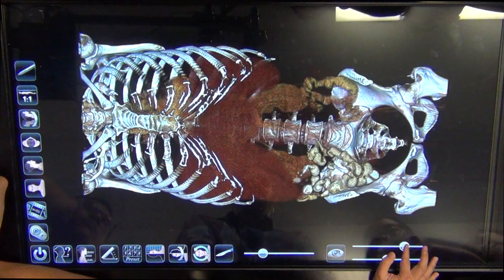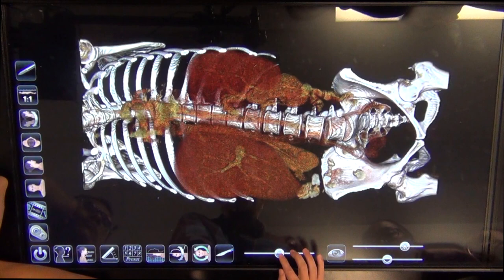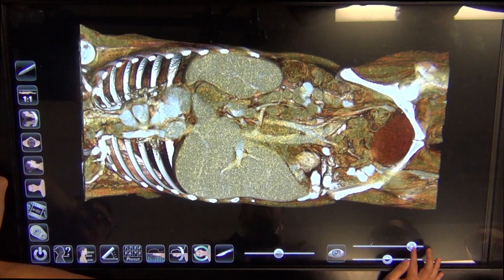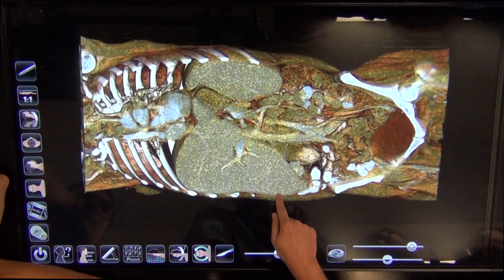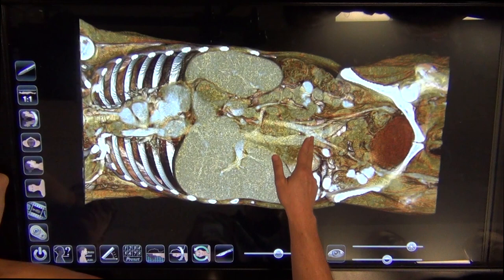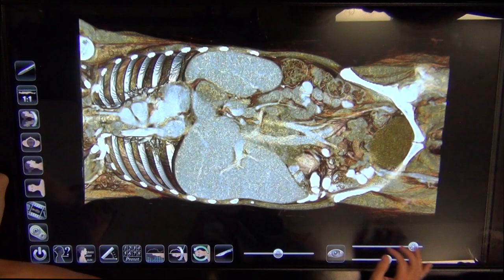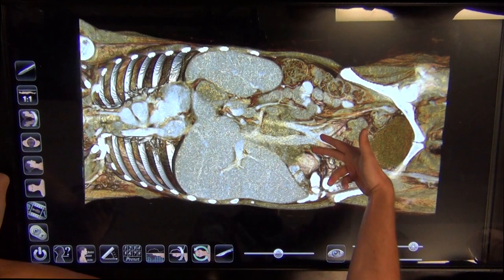So if we're looking at this from the front and pull this down, you can sort of see. It would probably be better if we cut the clipping plane this way and increase the density. Now we can see pretty well. That vessel there is the IVC. And this one is the left renal vein. Aorta versus IVC — which one has a higher bifurcation? The aorta is usually about L4, and then typically the IVC bifurcates at about L5.